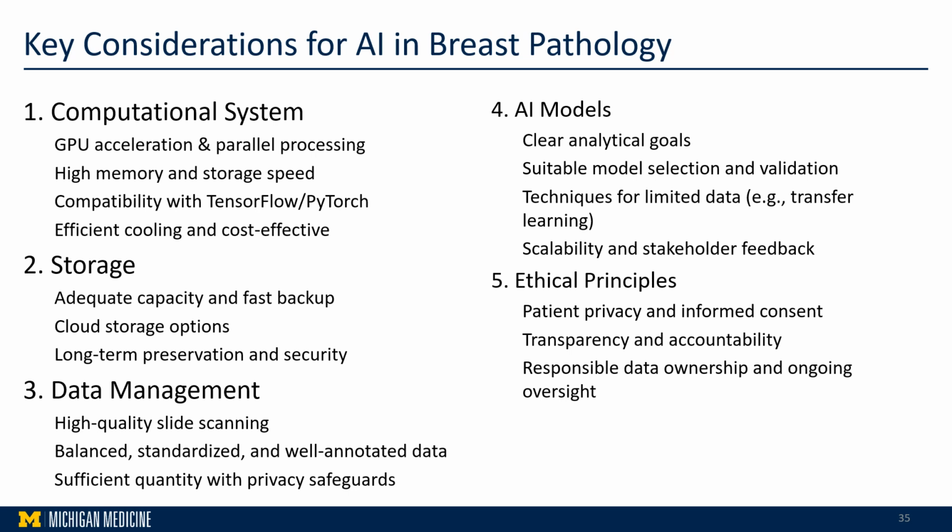Data quality is also critical, requiring high performance slide scanners, standardization, as well as a well annotated database, because of the old saying, garbage in, garbage out, and you need really sufficient quantity to ensure reliable models. Privacy and security must be strictly maintained. Selecting AI models should be guided by clear analytical goals with thorough evaluation and validation. Techniques like transfer learning can help with limited data, and models should be interpretable and scalable for future interpretation.